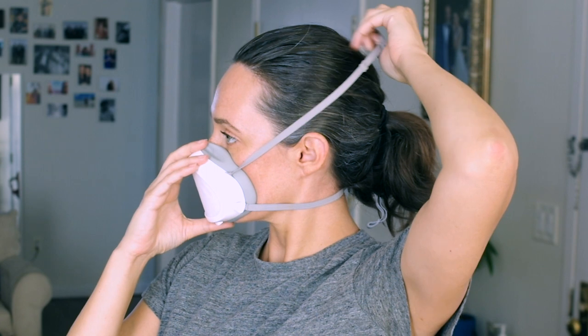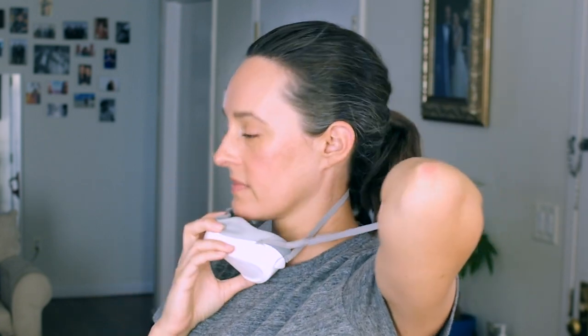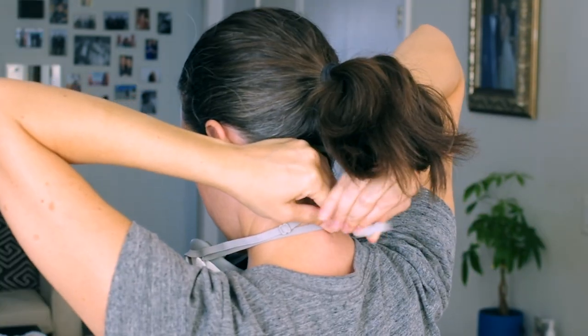Doffing the mask. Pull the mask down and let the mask hang below the chin. Loosen the bottom strap and pull the top strap down so the mask rests against the chest.